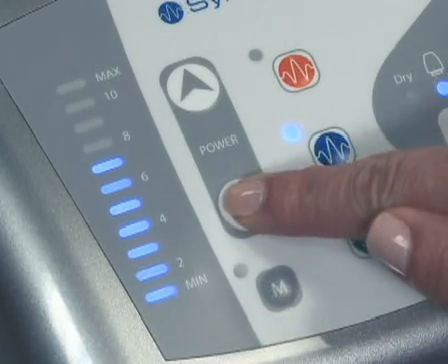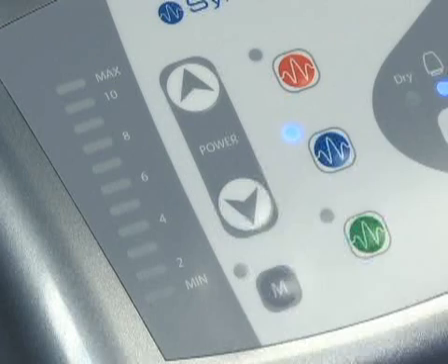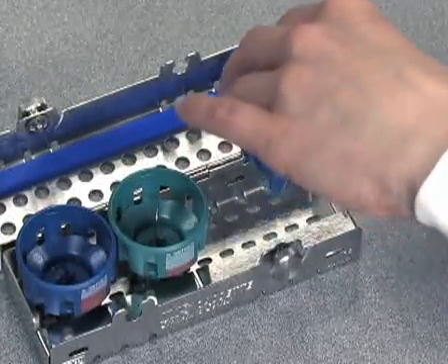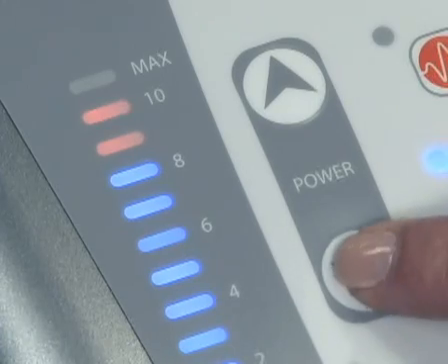When water only is desired for irrigation purposes, push the down arrow to the lowest power setting. The handpiece light will not illuminate; however, water will continue to flow. To ensure patient comfort and to extend the life of your tips, always use the lowest effective power setting.